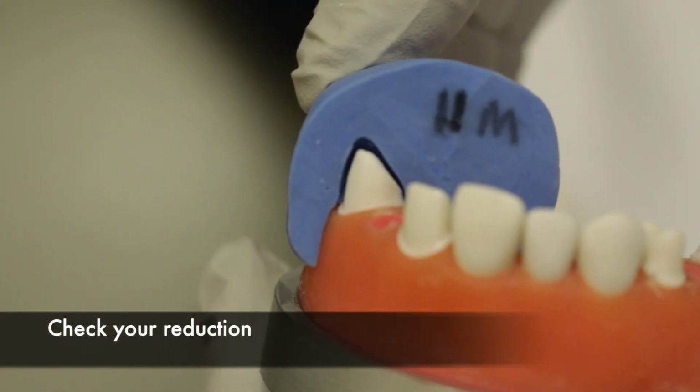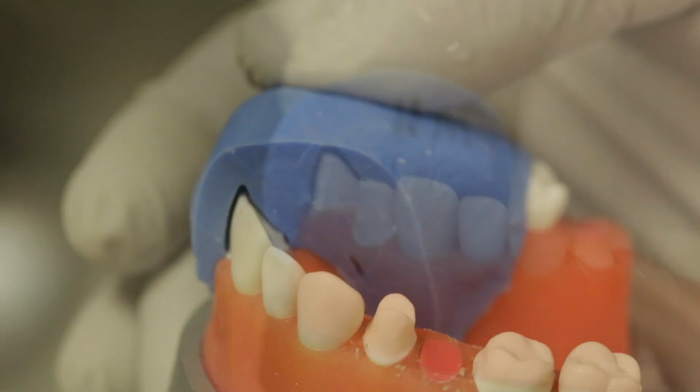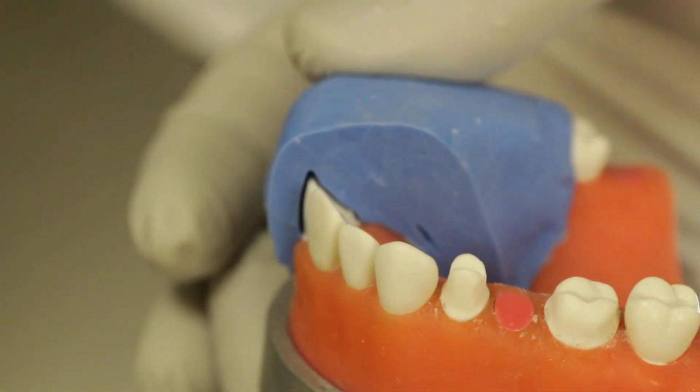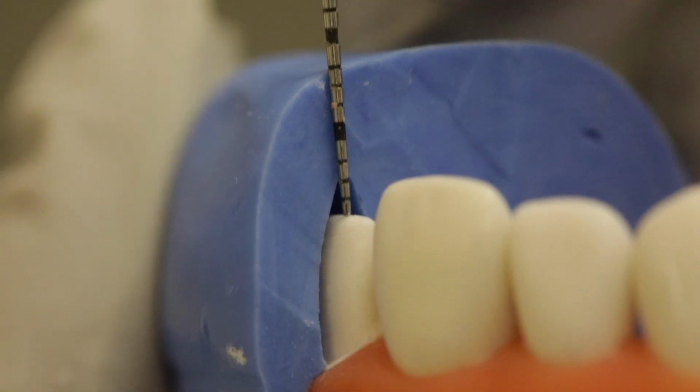Check with your putty matrix that you have enough reduction facially, incisally, and lingually. Use a perio probe to verify the actual reduction that you made.